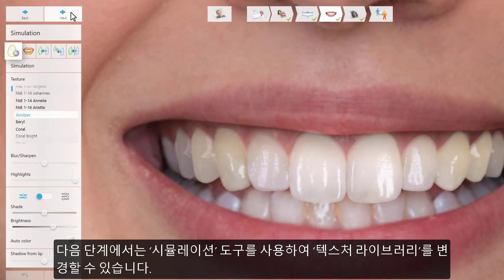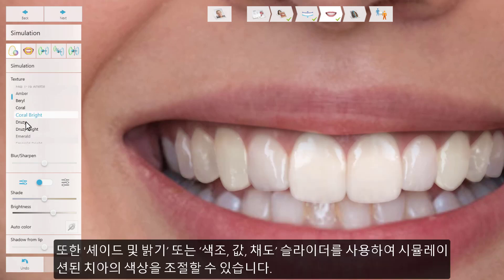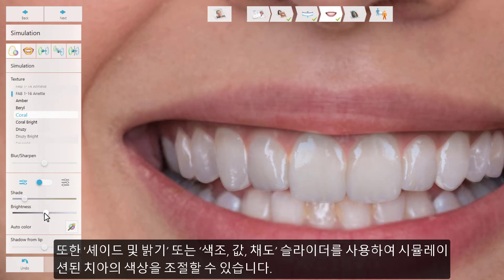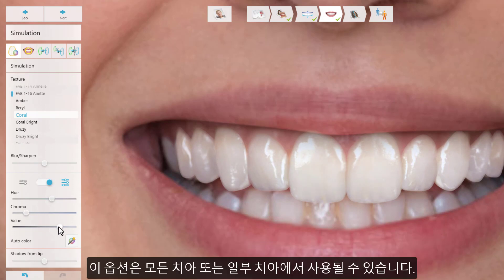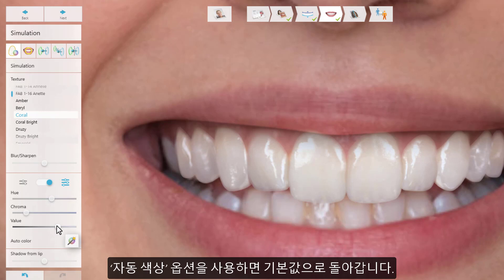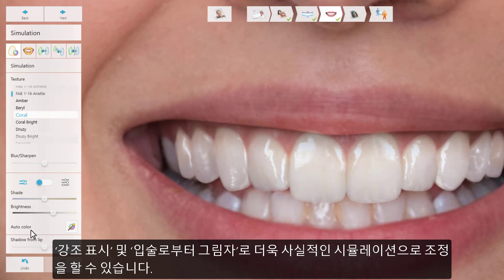In the next step, you can use the simulation tool, where you can change the texture library on the teeth. Using the sliders, you can also adjust the color of the simulated teeth using either shade and brightness, or hue, value, and chroma. This can be done for all of the teeth involved, or for just some of them. Use auto color if you want to restore to default. Highlights and shadow from lip can also be adjusted for an even more realistic simulation.